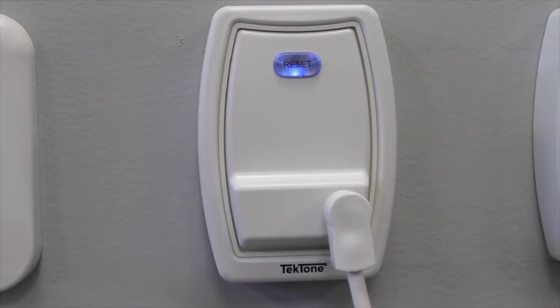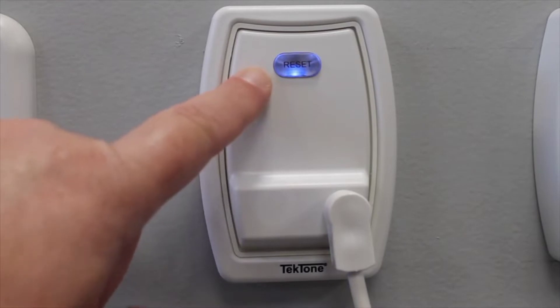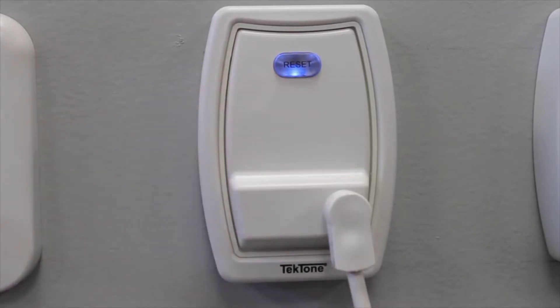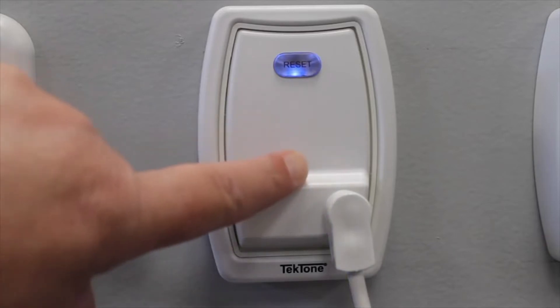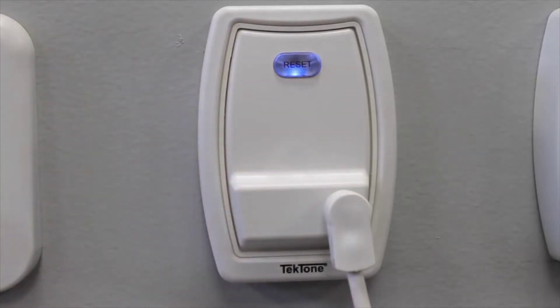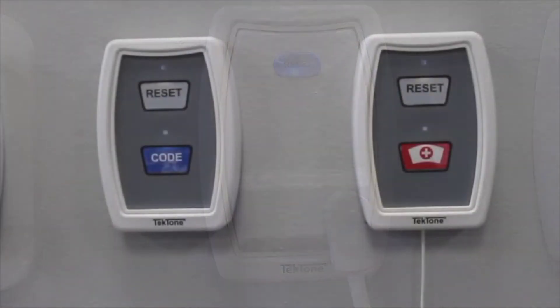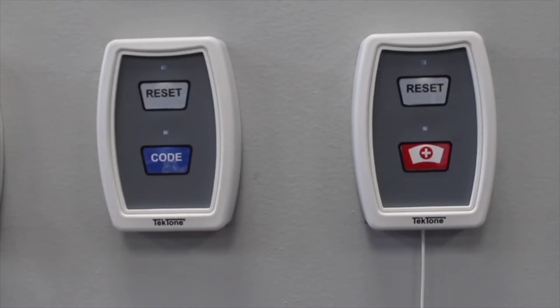Our single patient station features a quarter-inch jack which can be used with a variety of standard call cords, an illuminated reset button which will allow you to find the station in low-light environments, and a surface mount design which is great for new construction or retrofit applications. To place a call, the patient simply presses the call cord and a call is placed on the system. A call assurance LED will light to let the patient know that the call was placed. To reset the call, simply come to the station and press the reset button.